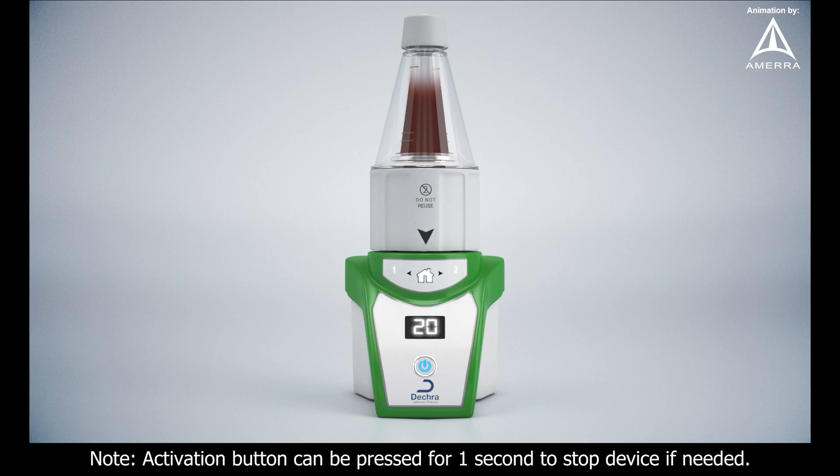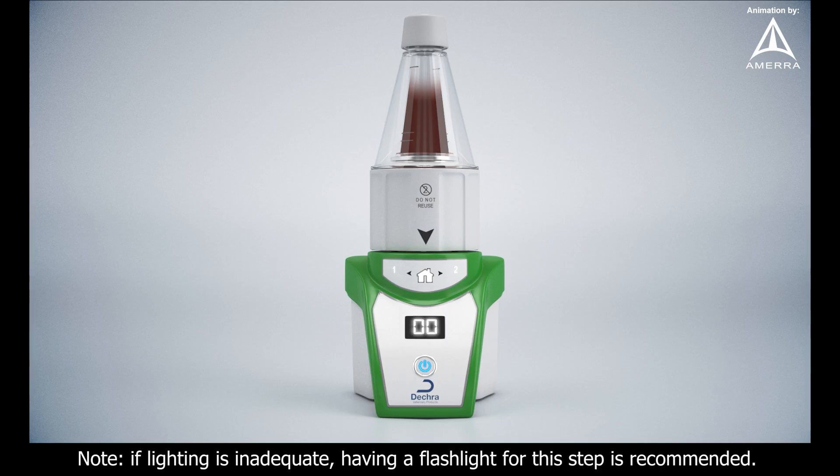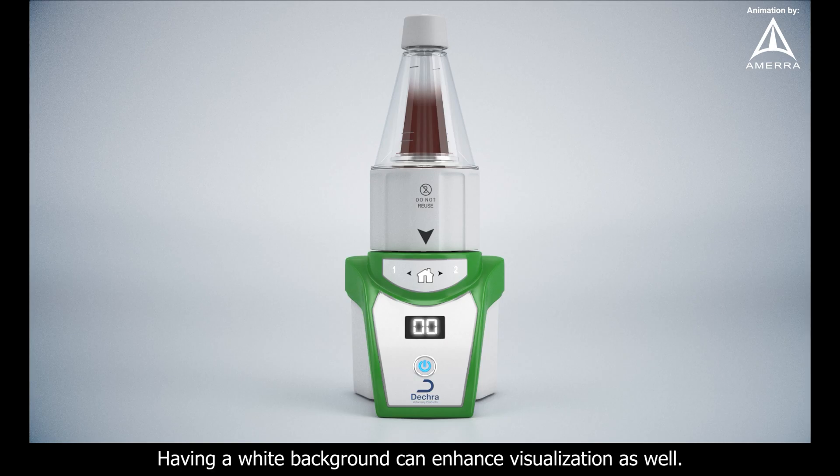Note: the activation button can be pressed for one second to stop the device if needed. Note: if lighting is inadequate, having a flashlight for this step is recommended. Having a white background can enhance visualization as well.